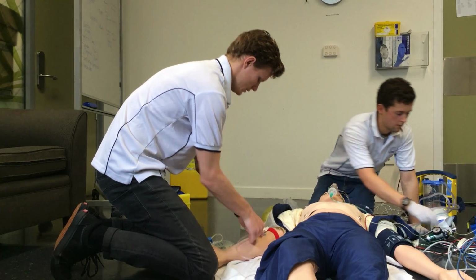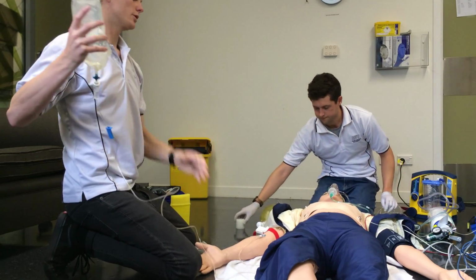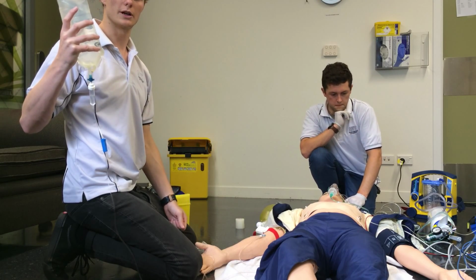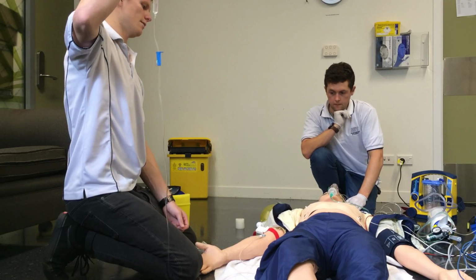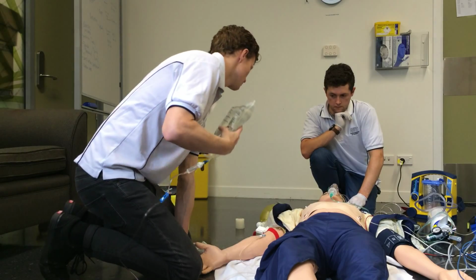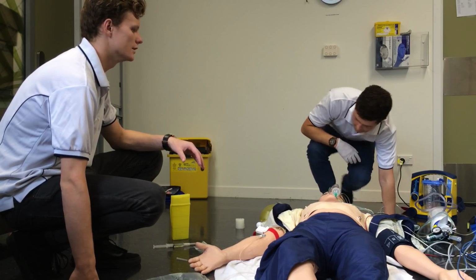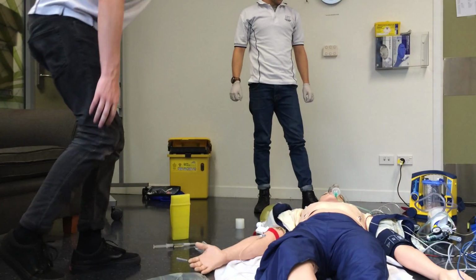Cool. So I'll open my bag up, run it. Sweet. So because this is a mannequin and not a real patient, I can't put an IV in the other arm, although preferably I would put an IV in that arm as well, a large bore in the ACF, and possibly look at running more fluids, however the blood pressure and stuff is good. Sweet. So Jacob, do you want to see how far away my ICP is? Do you want to go to the truck? Is there anything else that you think I should be doing at this stage? No, I think we just start tidying up and await arrival.